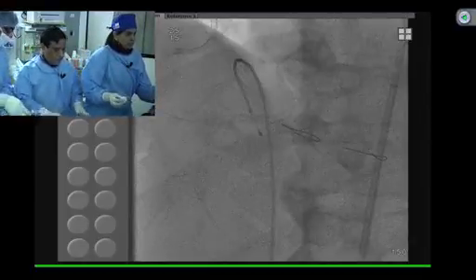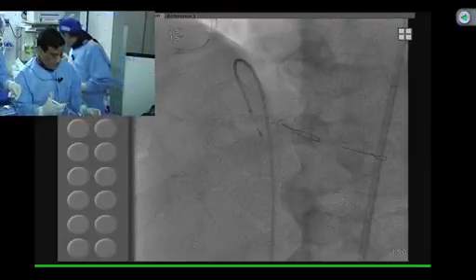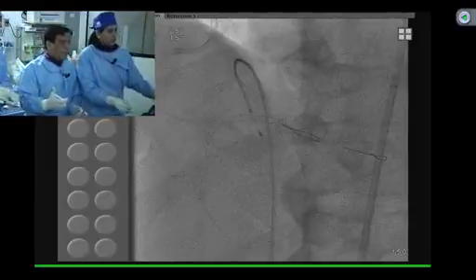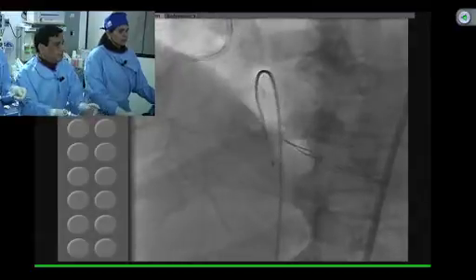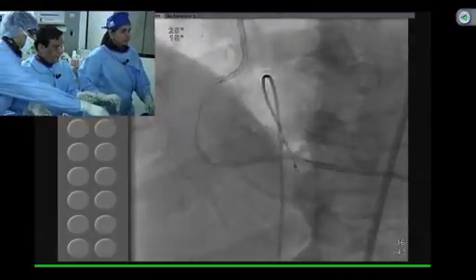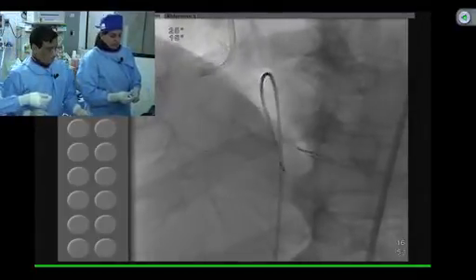And basically, you want to take a picture before we put a stent in the mid now. And the 28, 3.5? Yeah, 3.5, 4.0. Yeah, let's take a picture. Yeah, and then we have a mobile unit which can go to any other rooms, which we use sometimes. So I think we just put a stent in the mid and then we are done, and the rest we can just finish up with some post dilatation.